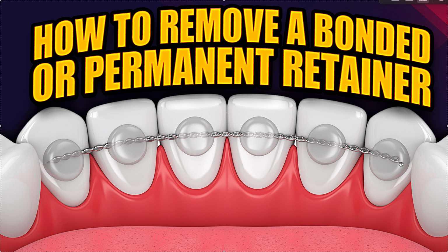I take my explorer, I do the scratch test, I run it up and down, and I see exactly where the enamel is. Then I can fine-tune and take it off with a finer burr. You can also use a black light to check for composite. It's really not that hard.